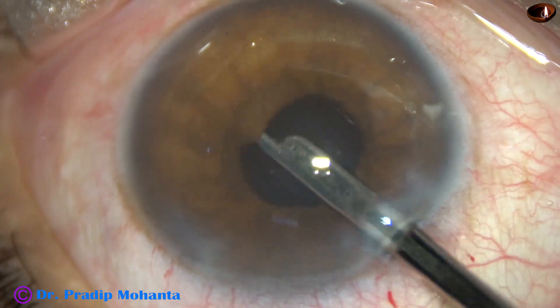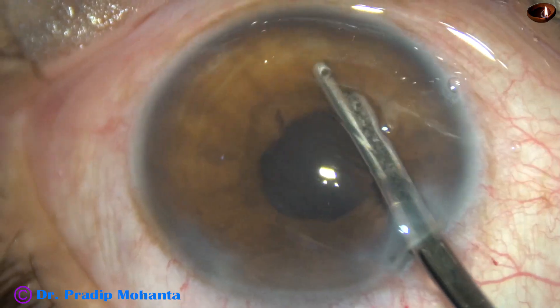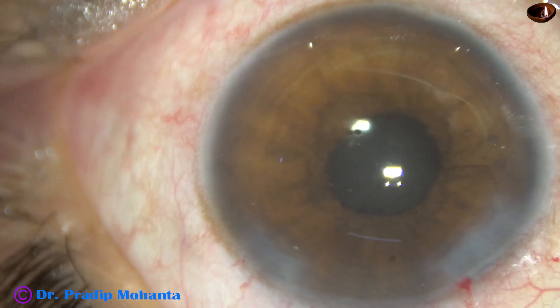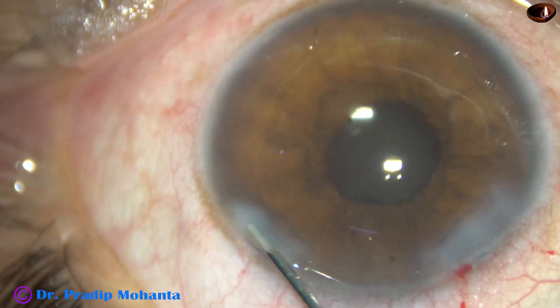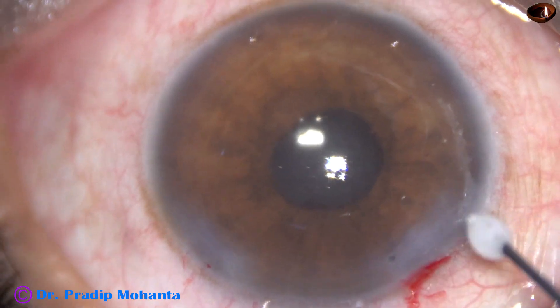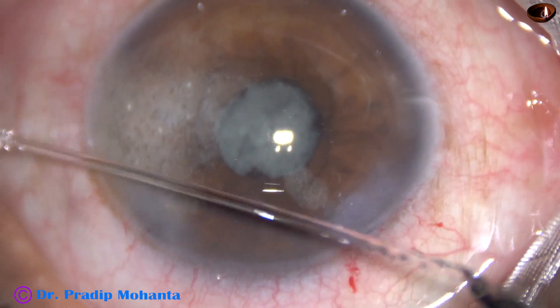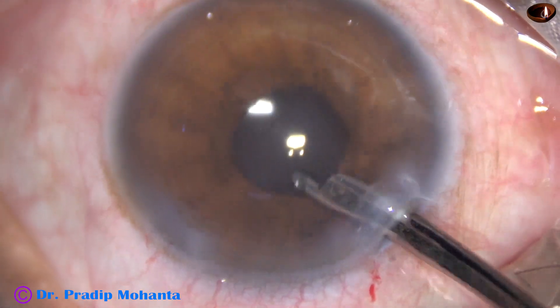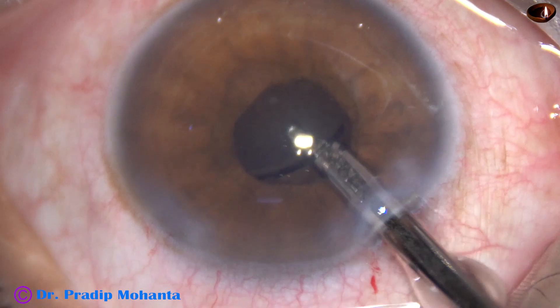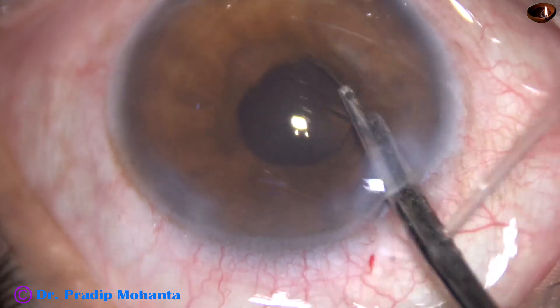This is the way to remove viscoelastic. We can also use bimanual irrigation-aspiration for removal. The side port is closed by hydrating the corneal stroma with BSS on either side of this stab wound. Since this is a case of post-uveitic cataract, a bit of Kenacort is injected, waited for a few seconds, and then washed out. Whatever few molecules of Kenacort remain after this washout will reduce inflammation significantly.